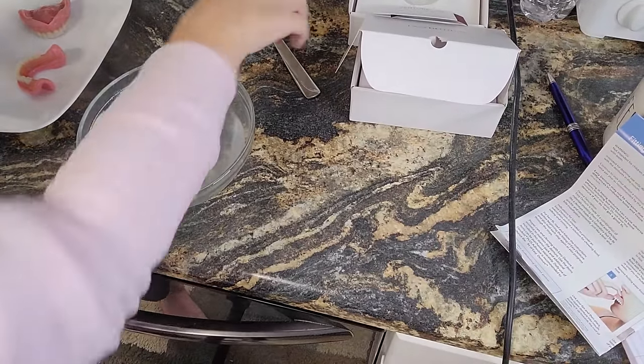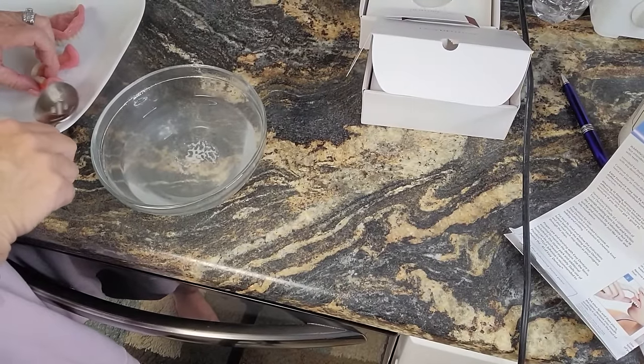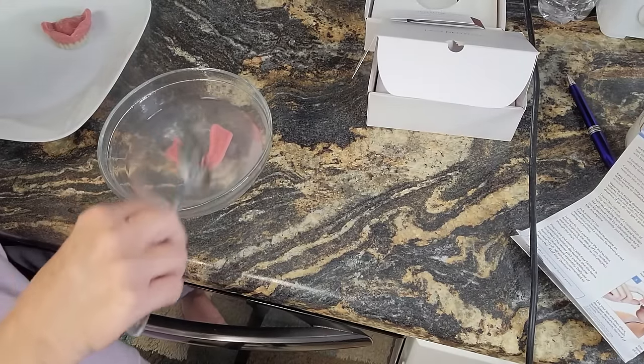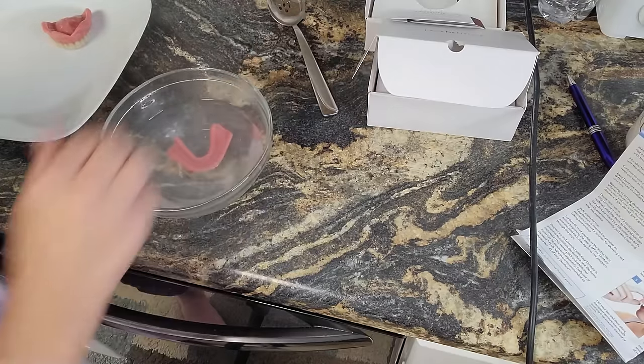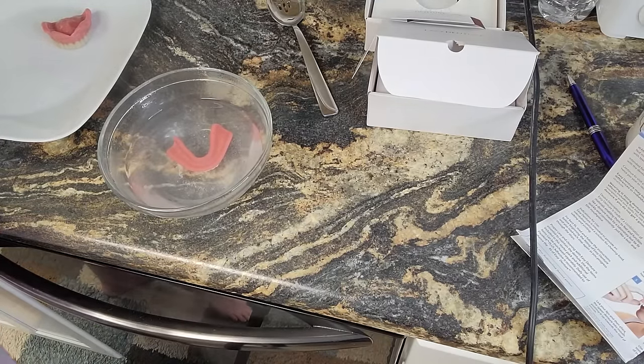All right, let's make the bottom ones now. We got the water — I'm just reheating it. Teeth down. 60 seconds, the timer's going. Now let's do the lower one — we have to put the upper teeth in because I need to bite. Look at those.